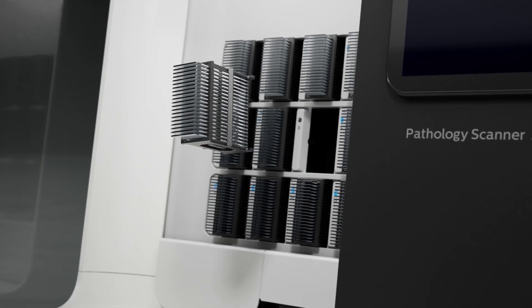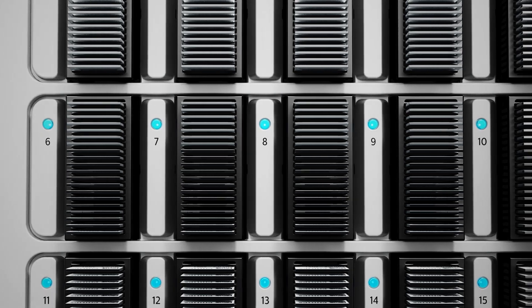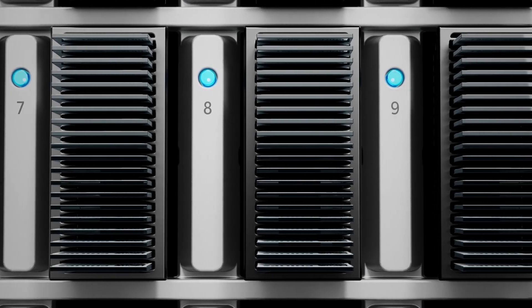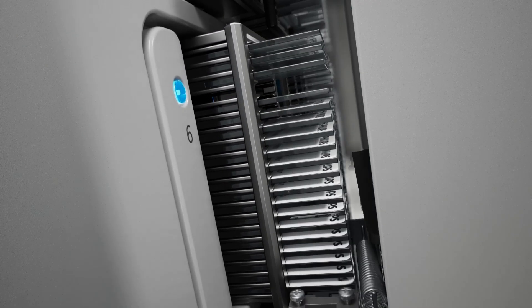Ready to scan? Simply load the scanner, close the door, and walk away. The Pathology Scanner SG does the rest automatically to minimize operator time so your staff can focus on things that matter most. You never waste a moment with a Philips Pathology Scanner SG thanks to workflow optimization.